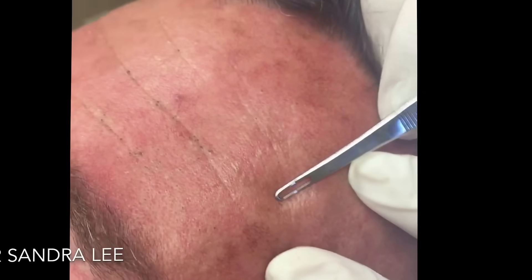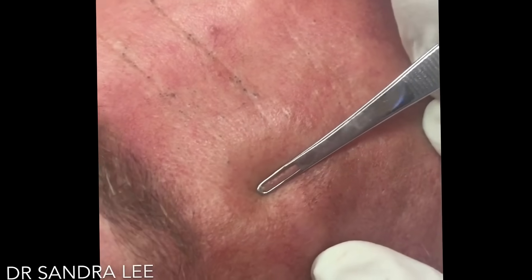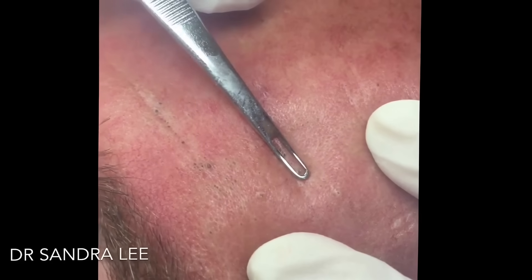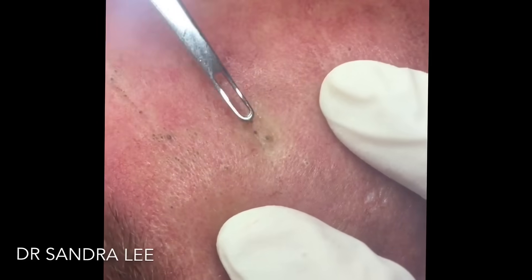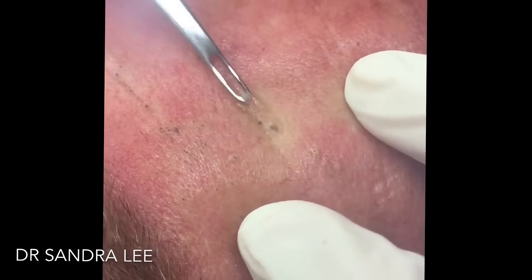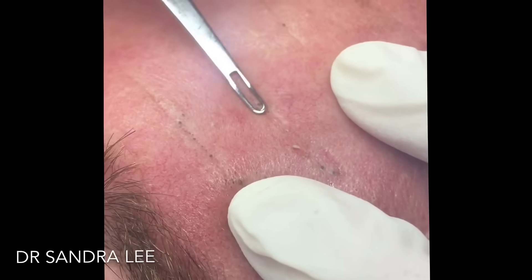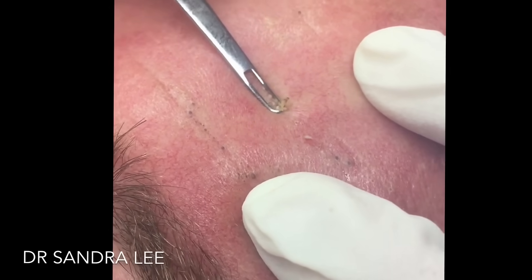Nice and clean. Let's go a little on his forehead — look at the ones along his forehead line here. Let's just clean those up. Some of them are a little tough — I'm gonna come back with a little bit of a nick in the skin to get them exposed a little bit.